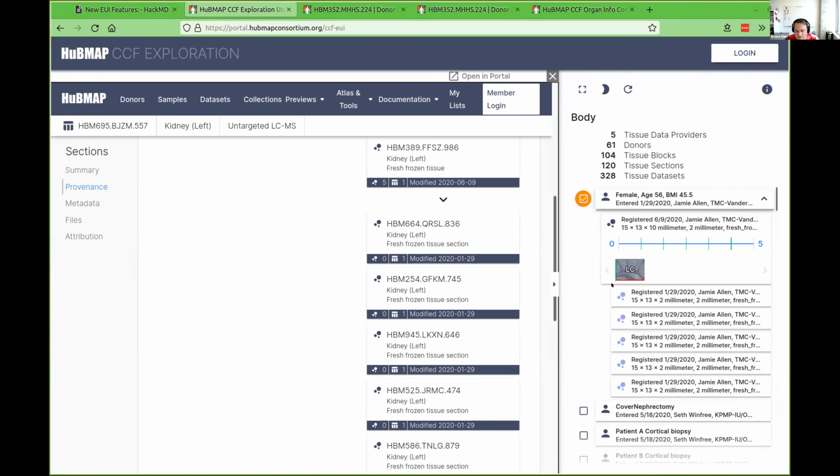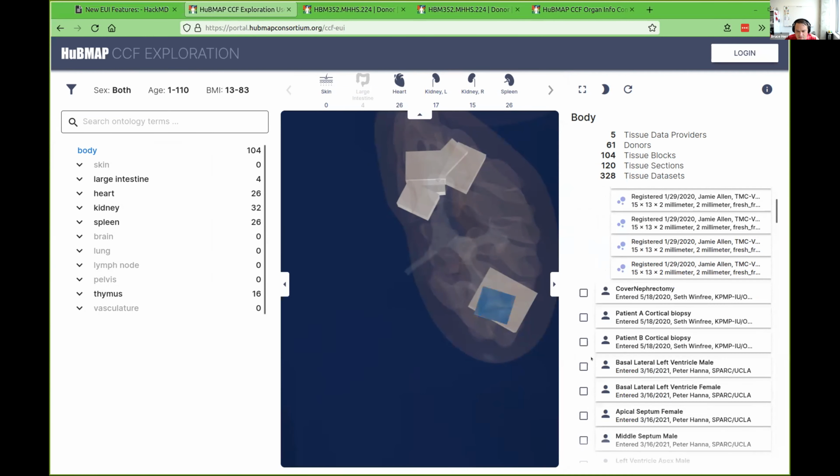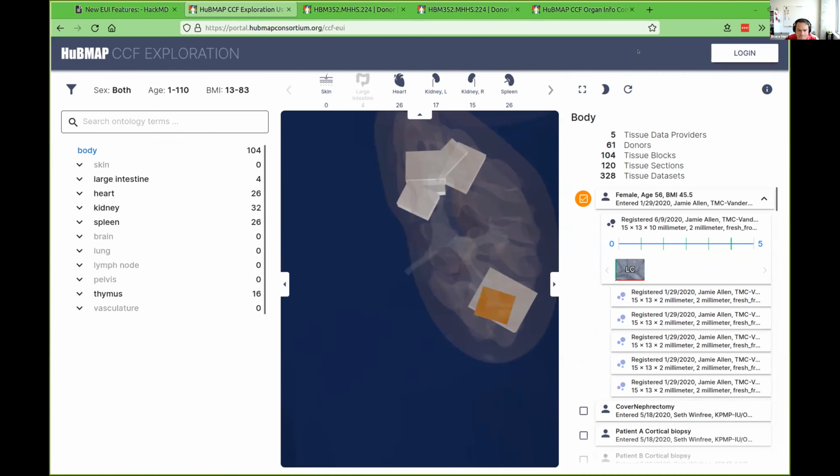Right now, we don't have really good data as far as tissue section ordering and thickness that we've been able to put into this visualization, but over time this will get a little more sophisticated. But essentially, this shows the sections in that tissue block, and the data is the data associated with that tissue. In this case, it's with the tissue block, but others are with tissue sections.